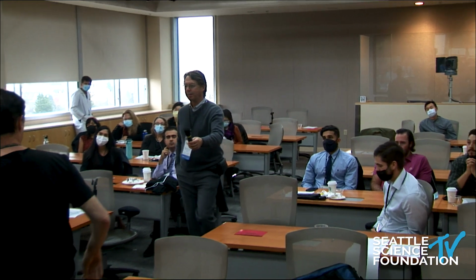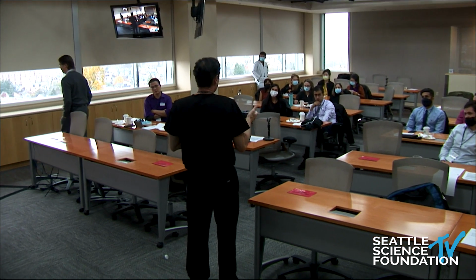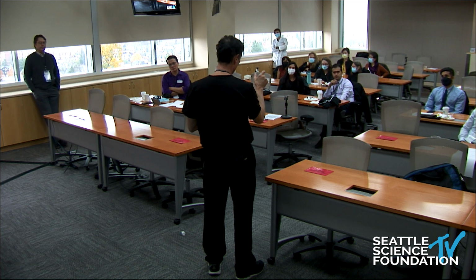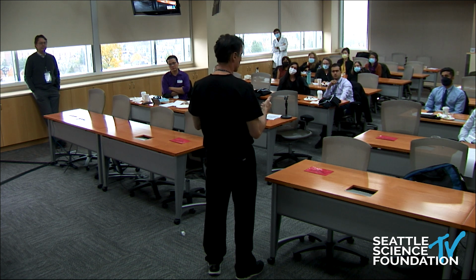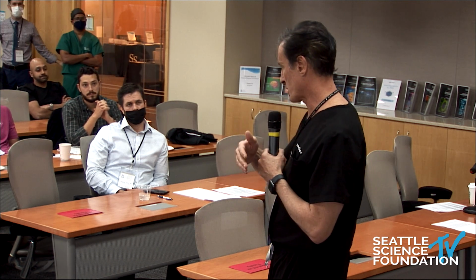That's absolutely true. There are a lot of misconceptions in vertebral augmentation, so listen up. Anytime you have retropulsion, anytime you have a posterior bowing, that's the way this breaks. Retropulsion exists because the interpedicular segment in the posterior portion of the vertebral body, superior third, comes back. That's how it fractures. People say if there's a fracture extending to the posterior wall, you shouldn't do the case, you're too high risk. That's nonsense. If you do something radical, like actually look at every single fracture coming through, you'll see fracture extension of the posterior wall commonly. Not the majority, but close to the majority of fractures.